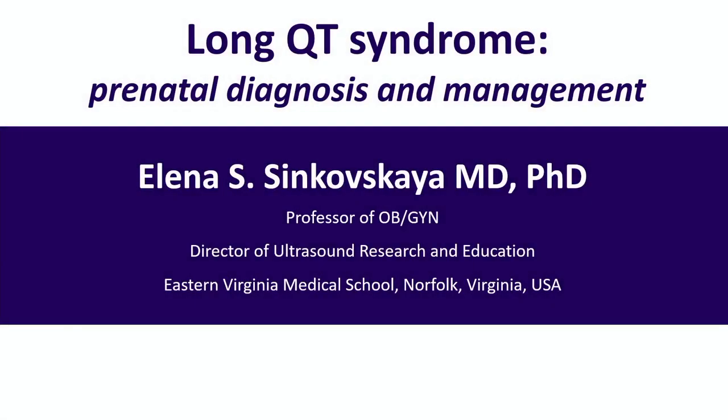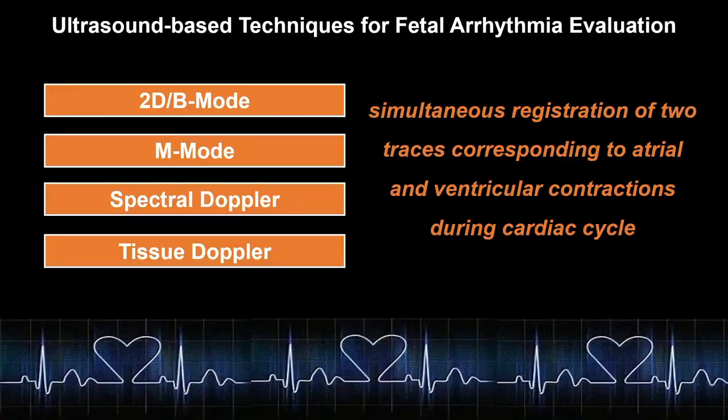This is my last talk, and we are going to review the presentation of the long QT during the prenatal time and the management of those pregnancies. But before we look into those affected by the long QT, I would like to remind you of the ultrasound-based techniques for the fetal arrhythmia assessment.